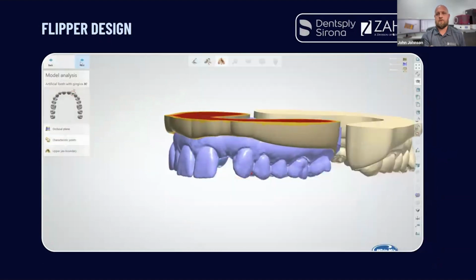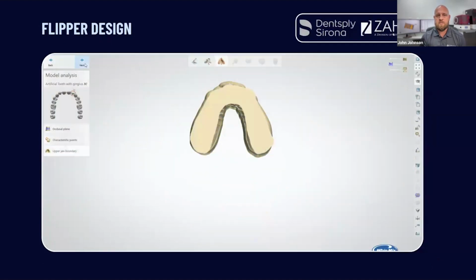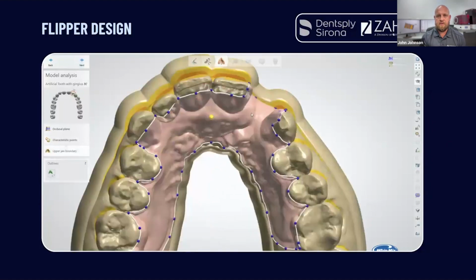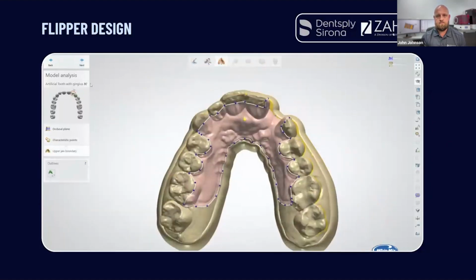And this is that flipper design. Again, it's going to take you through all those same steps. You're going to make your boundaries. Again, see how I'm lapping over those proximal teeth. And actually, I'll let this one show you exactly how that output comes out a little bit funny at the end when you get to the gingiva part of it.